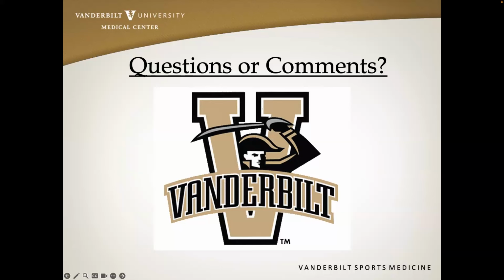If I detected even a small amount of fluid on my ultrasound exam, I'm going to default to a radiograph. And in fact, when you put up your list of the differential diagnosis, radiograph becomes even more important. So in the knee joint, I have a really low threshold for obtaining radiographs, even if the diagnosis is fairly obvious.